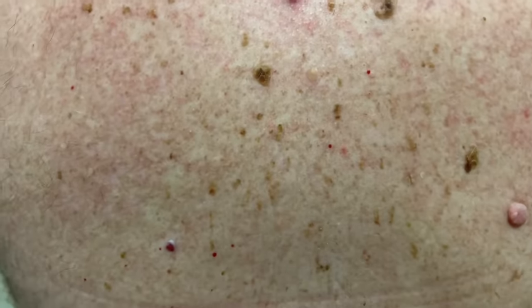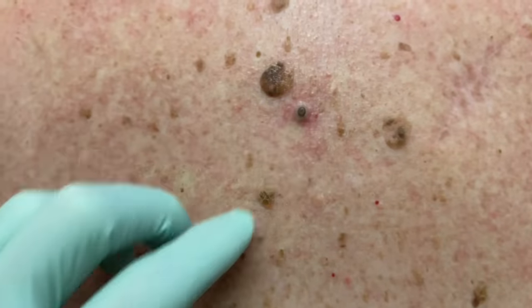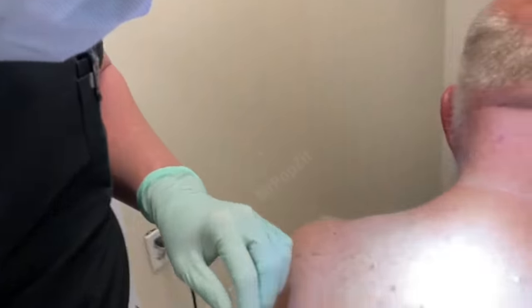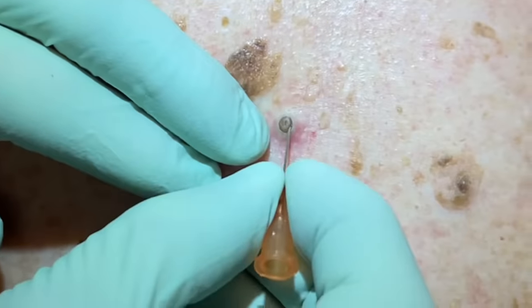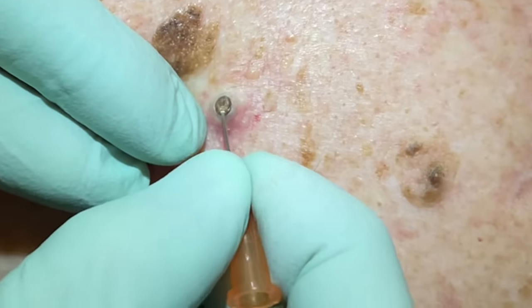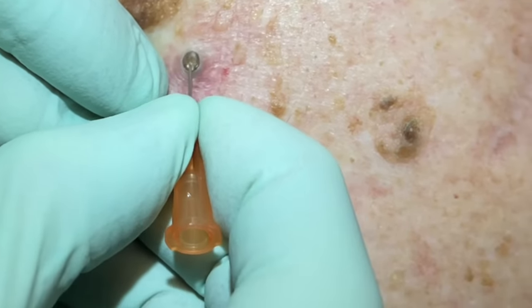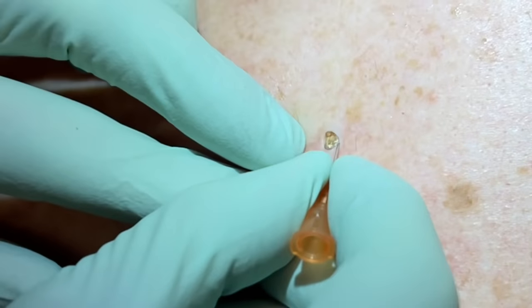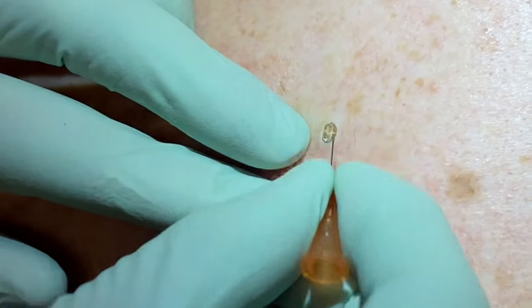A little bit of pressure with some q-tips usually loosens the pore a little and pops them right out. Greg Lynch, PA here — we have him all ready, wiped down. Just going to loosen up with a small needle here, put a little bit of pressure into these, move them around a little, and loosen up that dead skin from the edges.